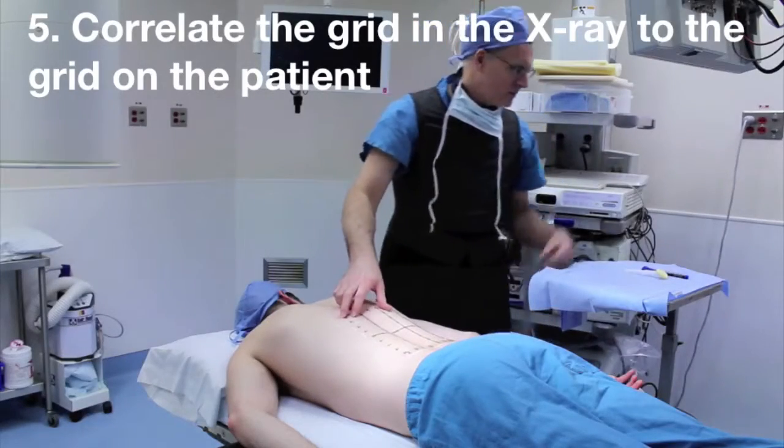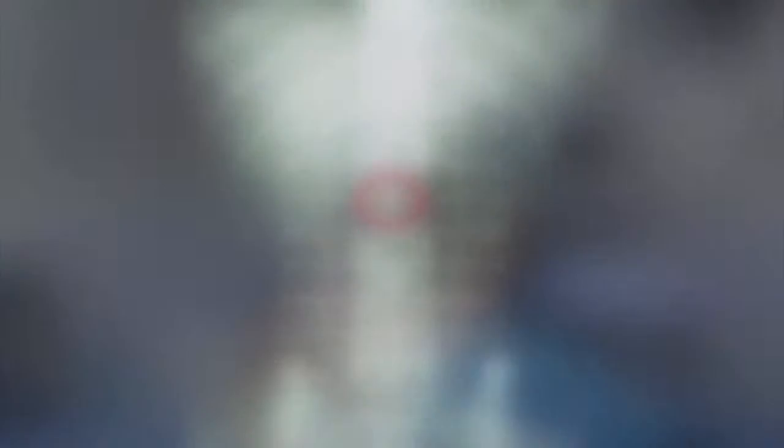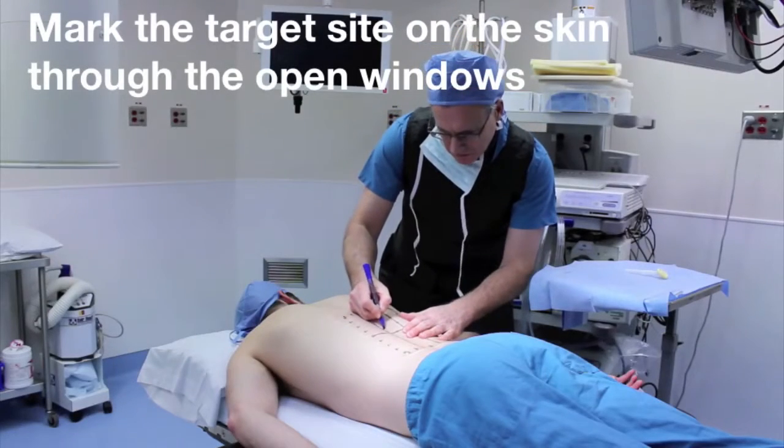Correlate the grid in the x-ray to the grid on the patient. Mark the target site on the skin through the open windows of the skin film.